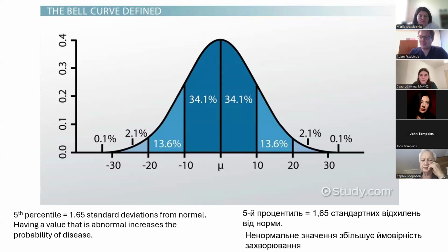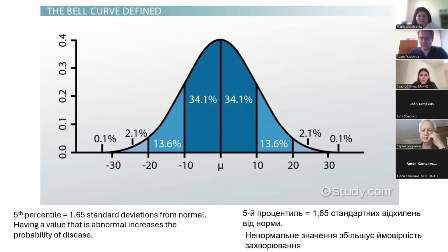So the test, to answer your question, is feasible and doable no matter the age, as long as you can follow the directions. That's the only limiting factor. But interpreting the test becomes more difficult at very advanced ages because we don't have a reliable distribution for the really old folks. Thank you.